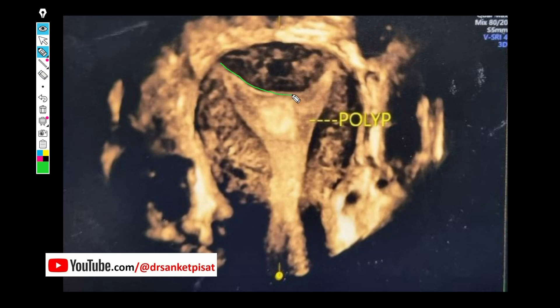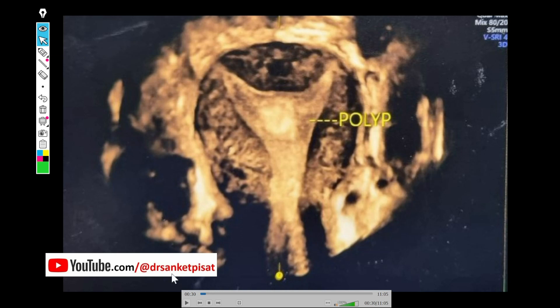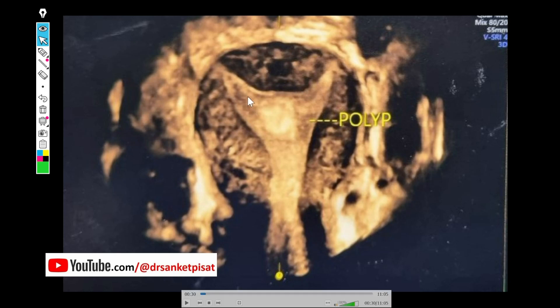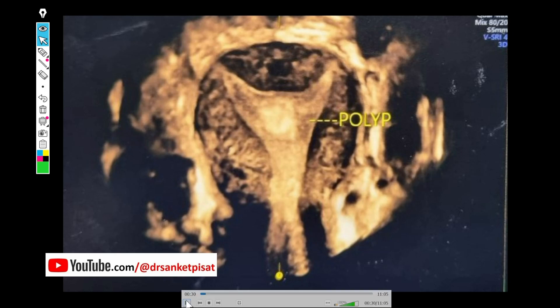Going by the ASRM classification, this angle is definitely more than 90 degrees, so you could say this is an arcuate uterus. The dilemma remains — by one classification system it is one thing, by the other it is another. But looking beyond classification systems into the patient's history, she does have a shape defect and proven failure of fertility treatment, so I would suggest it is good to correct this pathology rather than continue more fertility treatment attempts with this pathology intact.